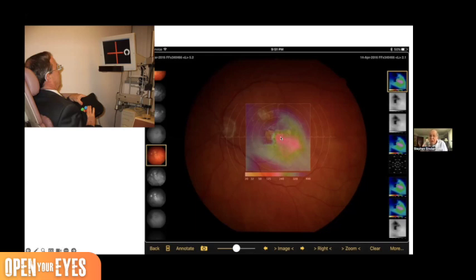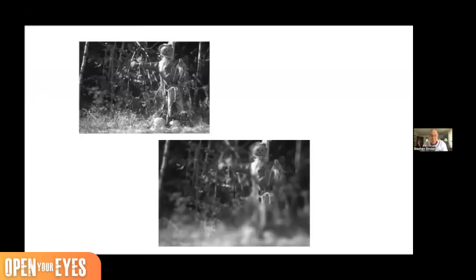So the problem with this guy is he has a right visual field defect that bothers his reading vision severely. So when we do a chart, we think, oh, he sees like that, like the picture in the upper left here. But this is his visual field. So it's interfering with his fixation abilities and motions, as well as his interpretation of associations within his field of view.